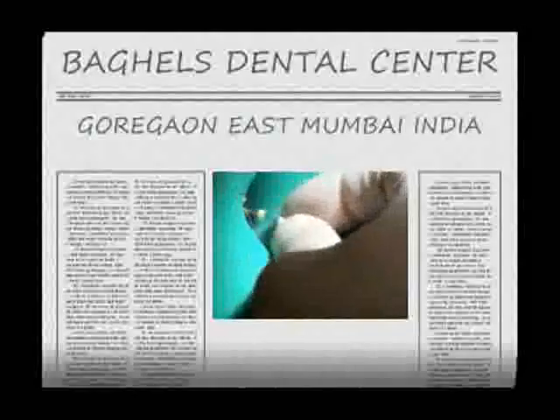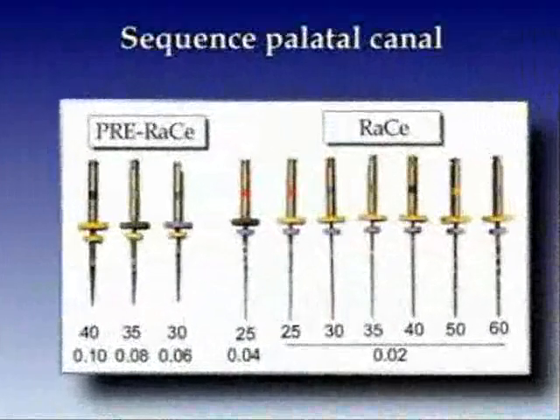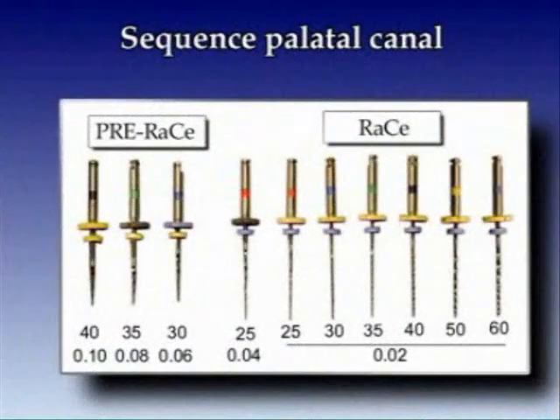The root canals are then hand instrumented at least to size 15 with stainless steel K-files. The engine-driven crown-down instrumentation can then begin and is carried out in wet root canals.